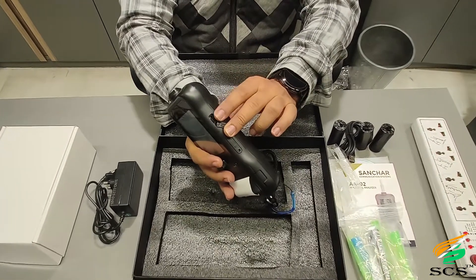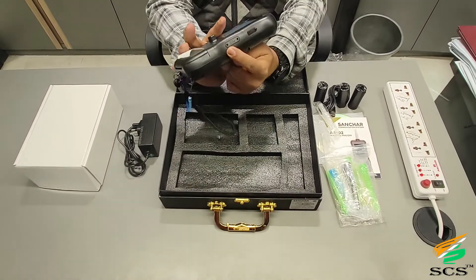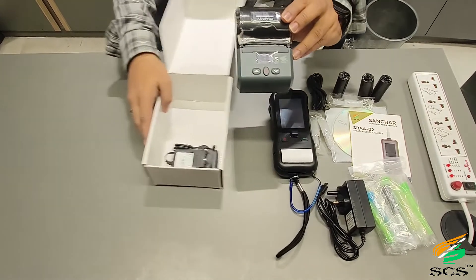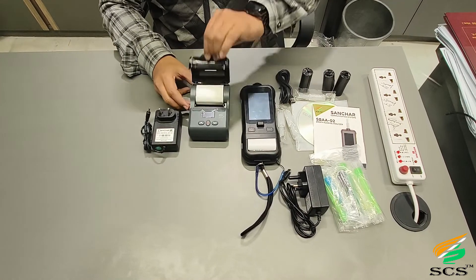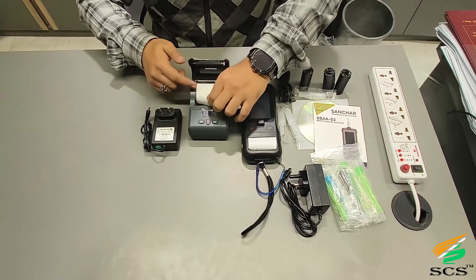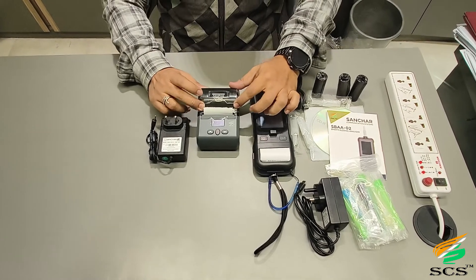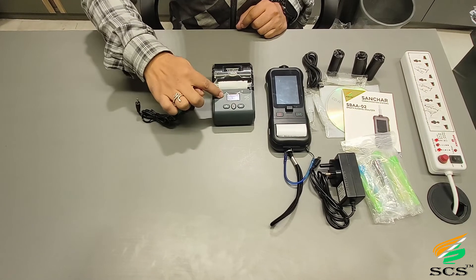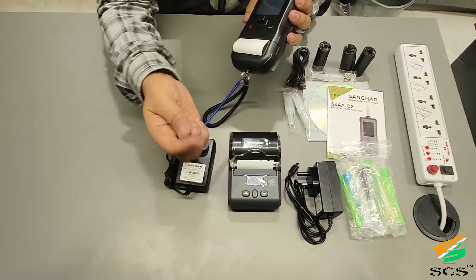This is the C-type charging point and this is the SIM slot. This is the portable thermal printer with its adapter — you can easily open it and insert the thermal roll. This is the lock and this is the charging point. This is the power on/off button; by pressing and holding this button you can start the printer. This is the stylus for typing.